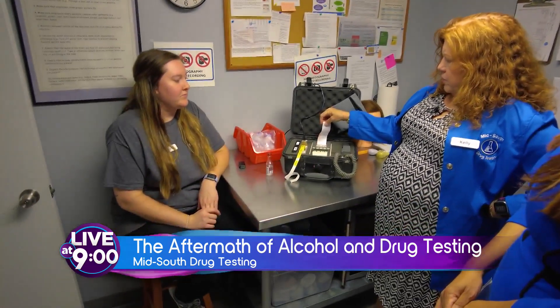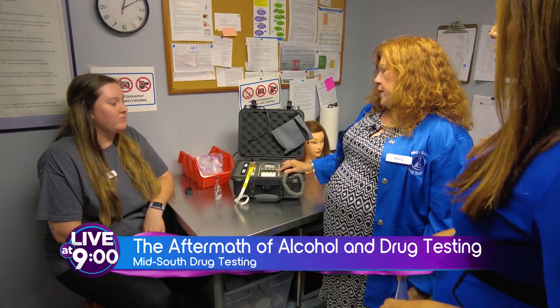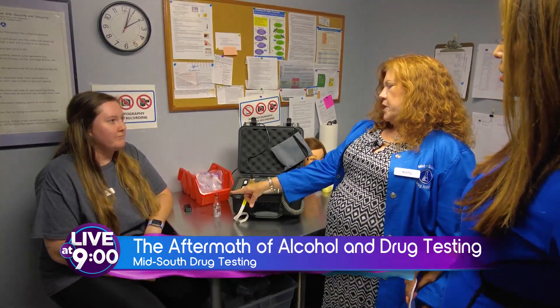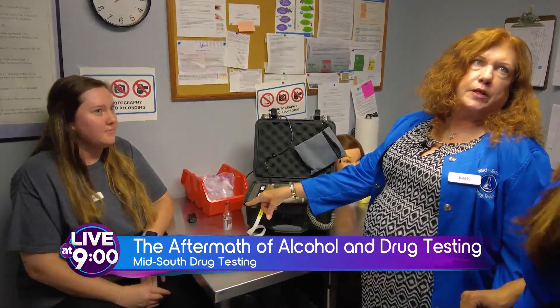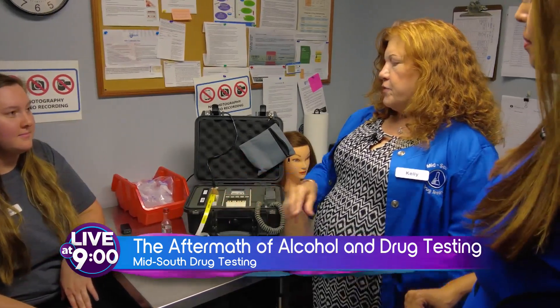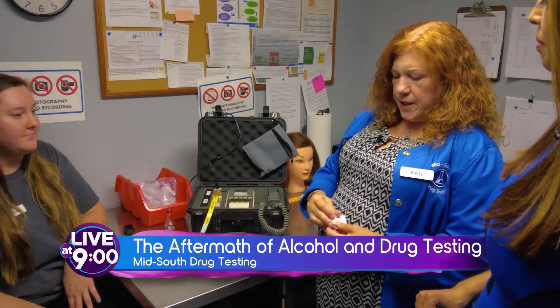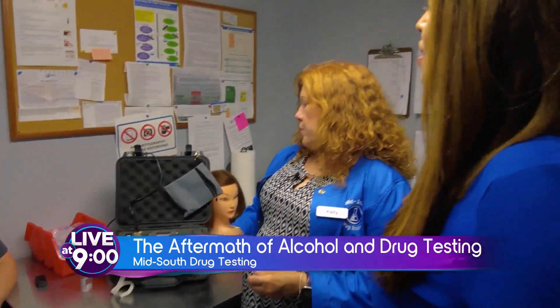Really? And now it's going to go into a confirmation — a 15-minute wait. The reason for that is because it is possible to use mouthwash, or have a mint in your mouth, and trigger a positive on the device. After 15 minutes when she does this again, it should come back negative because that's not actually in her body — that's just a little bit in her mouth.